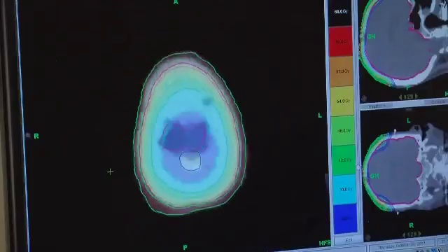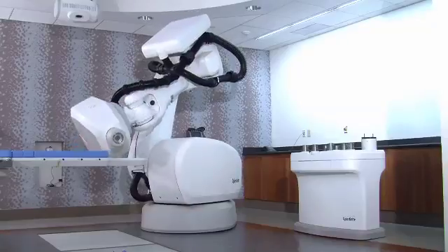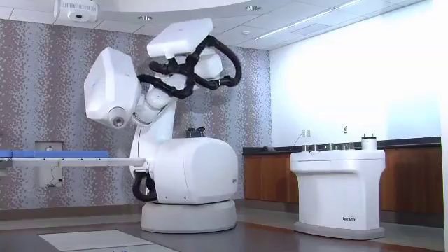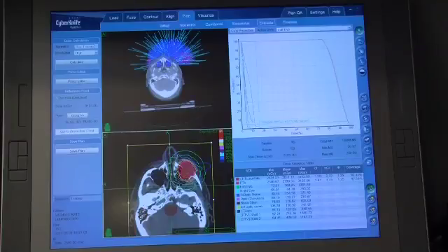My practice has substantially changed since the advent of CyberKnife. Whereas 20 years ago, the obligation for these kinds of tumors was to remove them entirely and accept the risks because you really only had one chance to cure the tumor surgically. Now I can treat the tumor in a multimodal way, remove only a part of it, the safe part, and leave the risky part of the tumor for radiosurgical treatment. Because of that, the outcomes are better, fewer complications, and the patients generally do better.